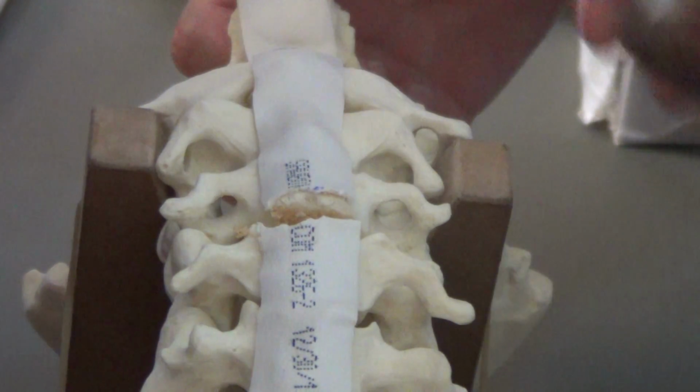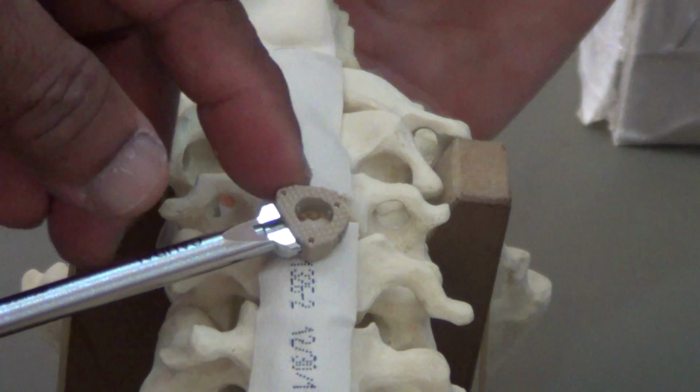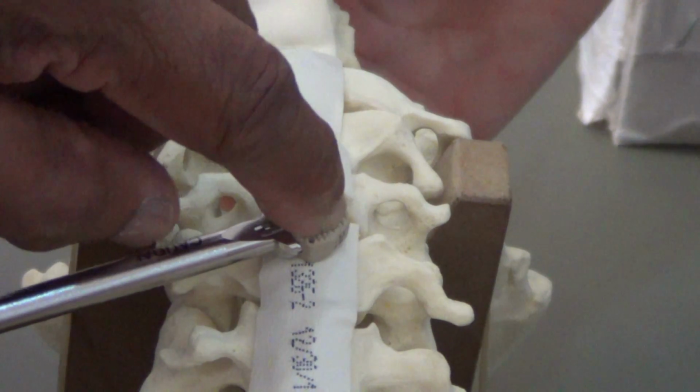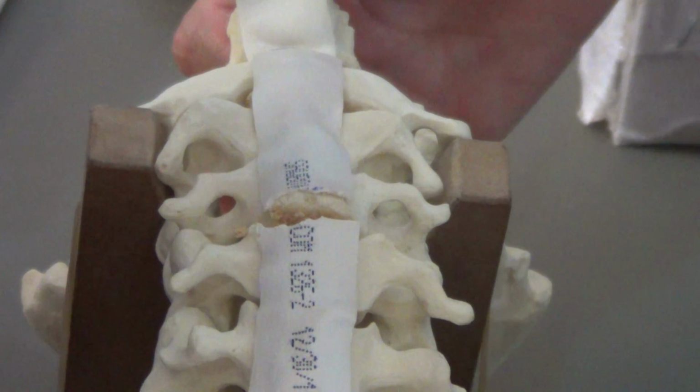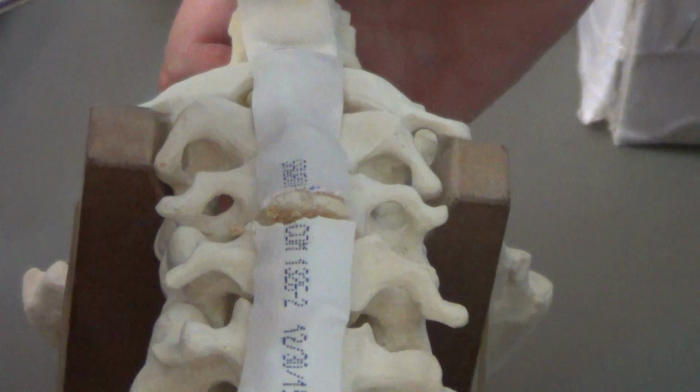Or nowadays they have come with cages. You see, this is a cage. You find there is a T cage. There is a hollow in the center, and in this hollow we can put a bone graft, either a bone allograft or autograft bone graft.